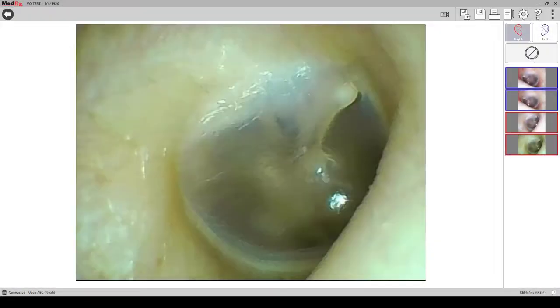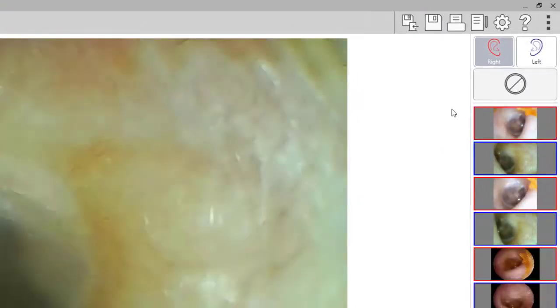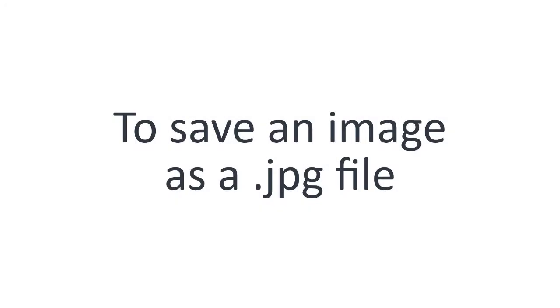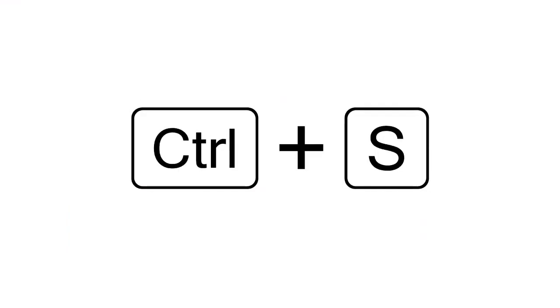You can save your session by clicking on the save button at the top of the screen. If you close Studio before saving, the software will prompt you to save. To save an image as a JPEG file, click on the image and then hit CTRL-S on your keyboard.